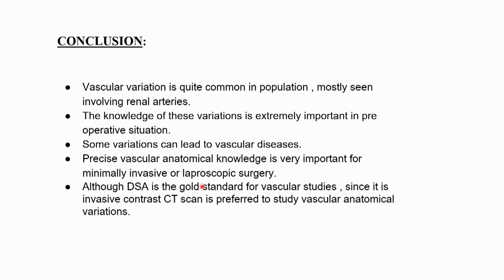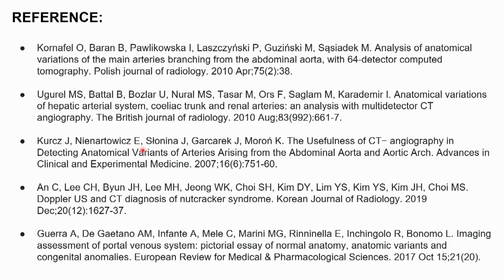Precise vascular anatomical knowledge is very important for minimally invasive or laparoscopic surgery. Although DSA is the gold standard for vascular studies, since it is invasive, contrast CT scan is preferred to study vascular anatomical variations. These were the references that I used.